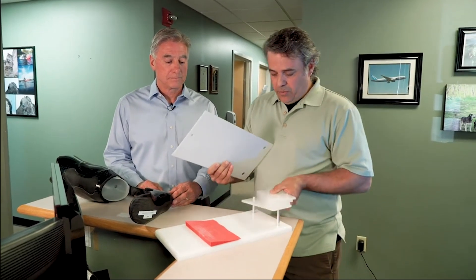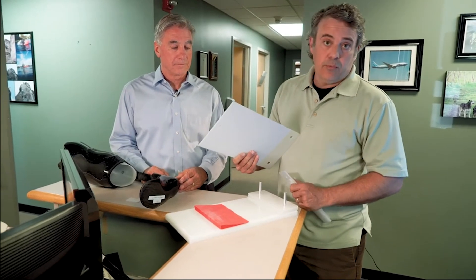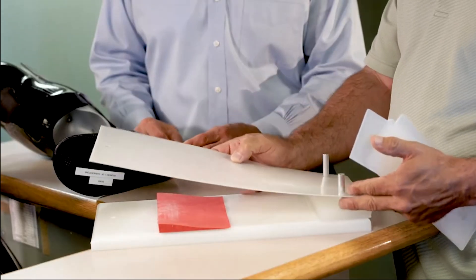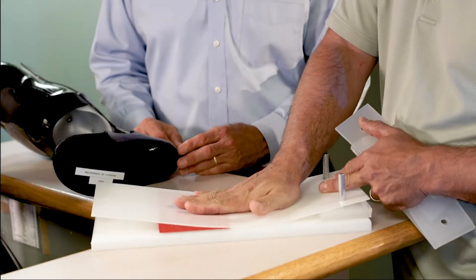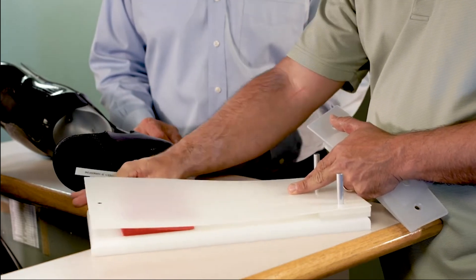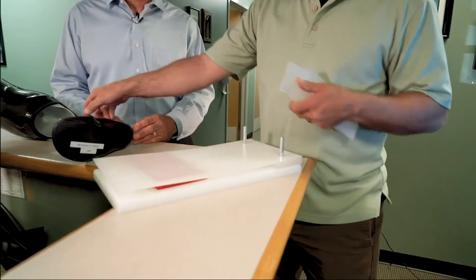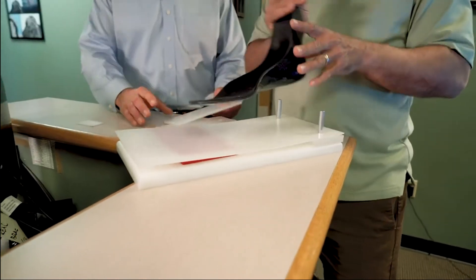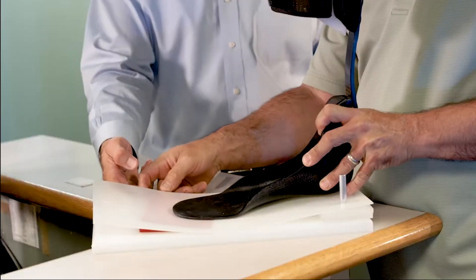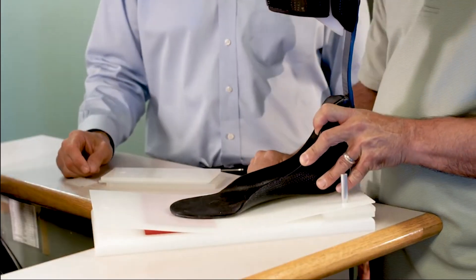To set up the fixture, we'll position whatever heel height we determine is needed through the evaluation process. We'll apply our top sheet, which allows everything to conform, and then we have our toe rocker wedge which sets how much toe rocker there is in the device. When we're done, the patient will be on the casting fixture and we'll be able to slide the toe wedge in to get the toe rocker we're going for.